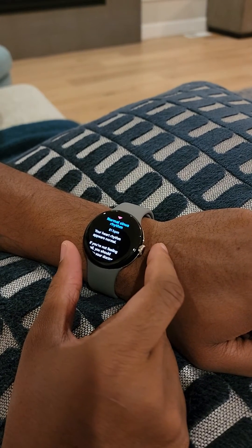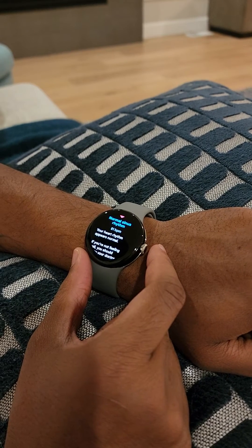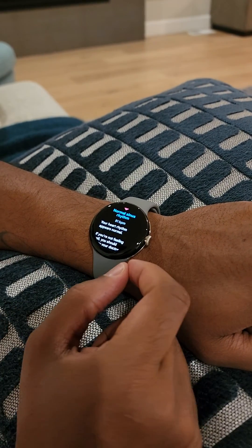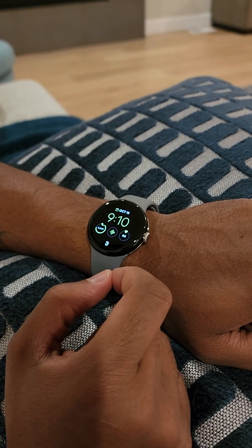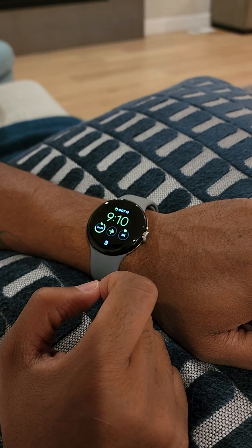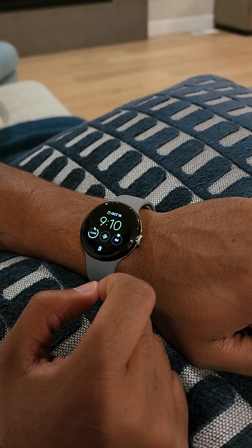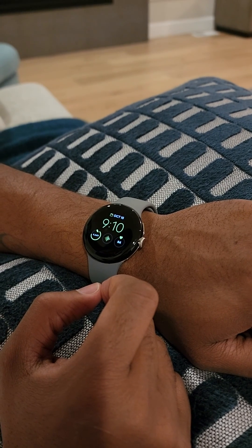But it was frustrating for me because for some reason it was saying it was installed, but I could not find it on my Pixel. So what I had to do was go to the Play Store, search for the application, update it, and then you'll actually see it as an option for a tile on your phone. So hope that helps — it was really frustrating initially because it wasn't as straightforward as I thought it'd be.